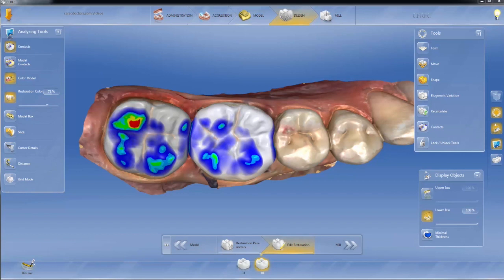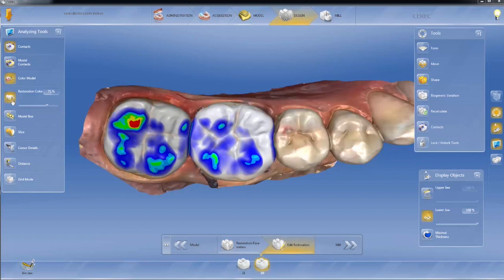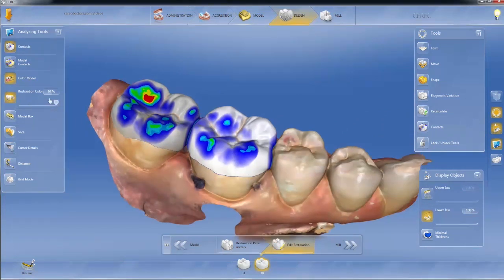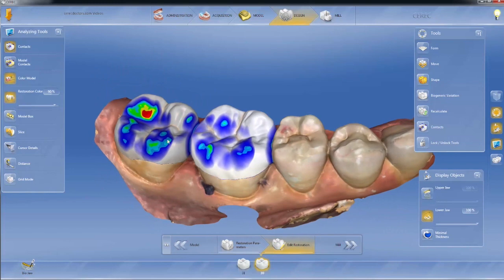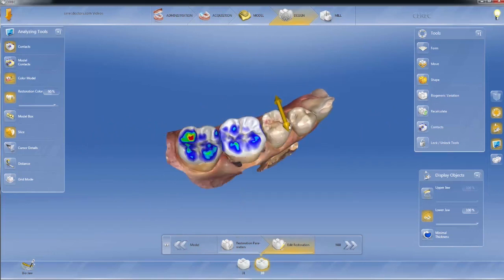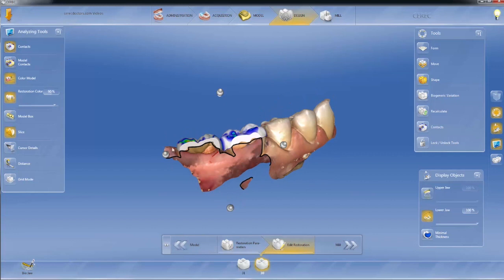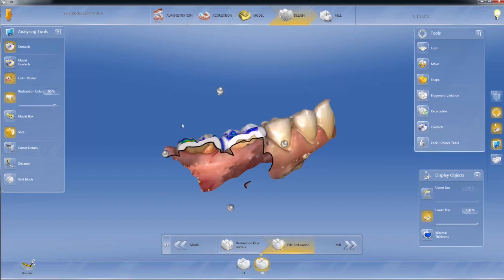We have the same thing with the analyzing tools — I can set this big or small. The one new analyzing tool we do have — everything else is the same as before. We have our contacts that we can turn on and off, our model contacts, and we can make our model black and white or color, change the restoration colors, and adjust the shade. We can turn our model box on and off; with it off we can look at the preparation from underneath. We have our slice window, which is slightly different — when you slice, you have arrows and can drag in whatever direction you want.